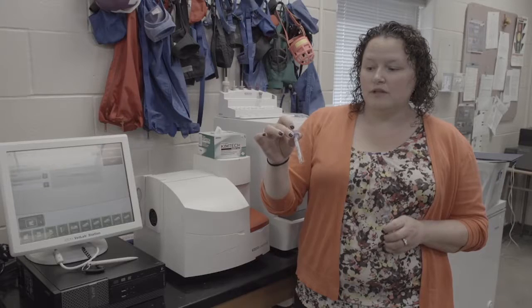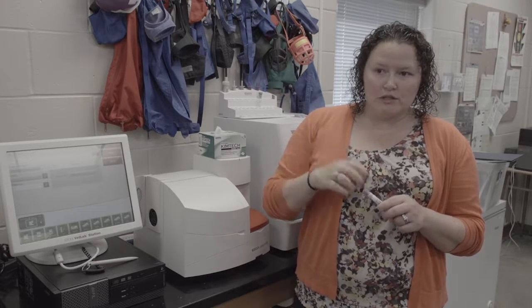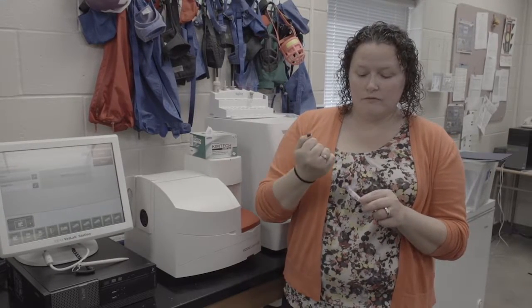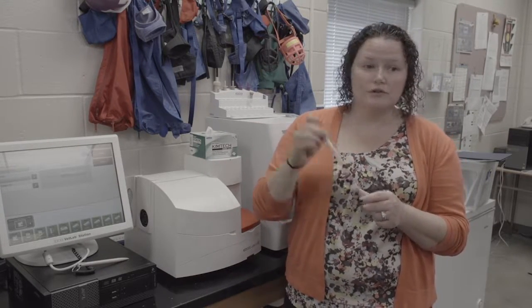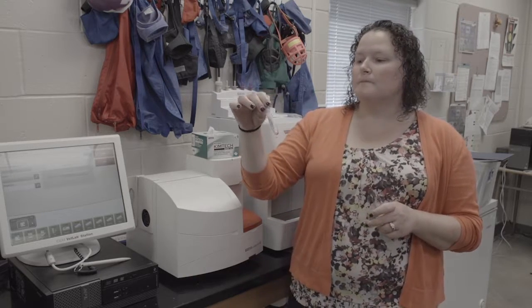You want to make sure that when you fill it, you're filling through the top, so pierce the top of the tube and let the suction of the tube take the blood in. If, say, you use that really tiny 25 gauge needle on that little kitten that's sick and you don't feel comfortable pushing the blood back through the needle, you can remove the cap or the top and then take the needle off your syringe and fill the tube that way. Just make sure that when you put the cap or lid back on, that you vent the tube with a needle by sticking just the needle down in and letting any back pressure off, because you don't want the analyzer to get a bunch of air when it's the first thing to pierce the tube. Does that make sense? Okay.